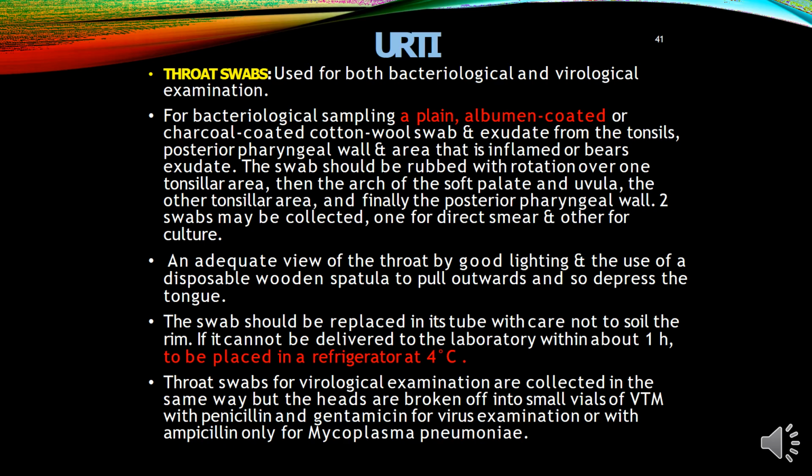An adequate view of the throat, with good lighting and a disposable wooden spatula to push down the depressed area of the tongue, should be used. The swab should be replaced in its tube with care, not spoiling the rim. If it cannot be delivered to the laboratory within 1 hour, place it at 4 degrees Celsius.